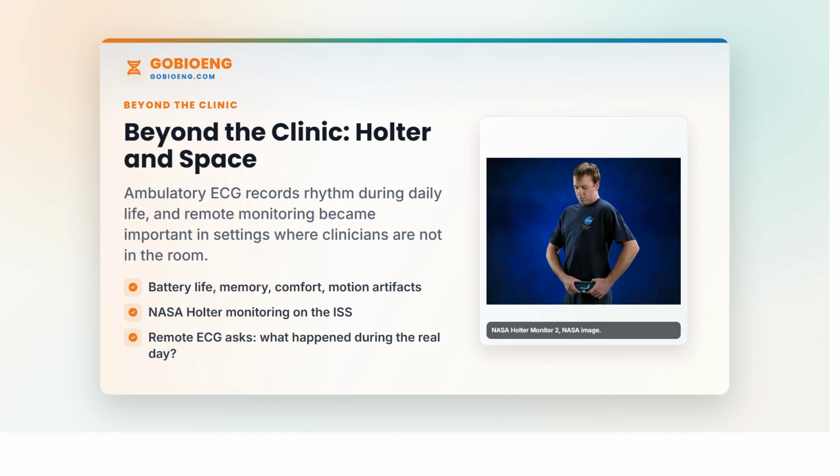But it is not the same as a hospital 12-lead ECG. It is a limited single-lead recording designed for specific use cases such as rhythm awareness. Skin contact, motion, algorithm limits, regulatory approval, and clinical follow-up all matter.